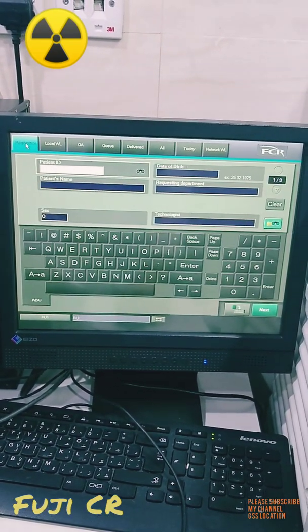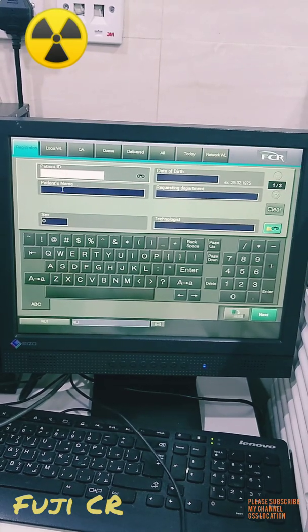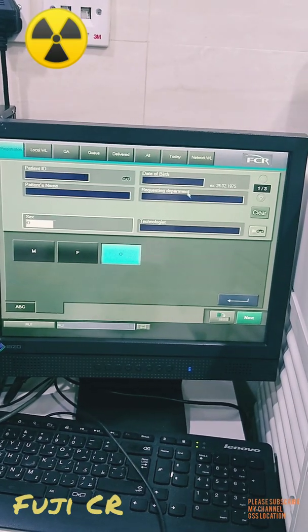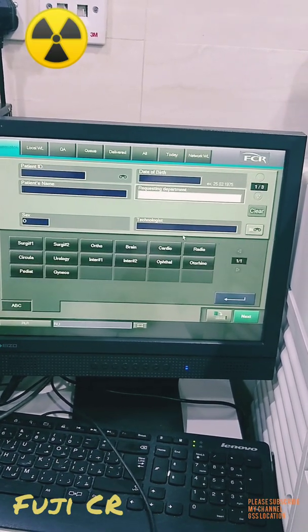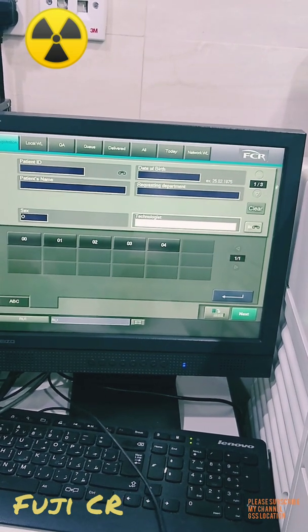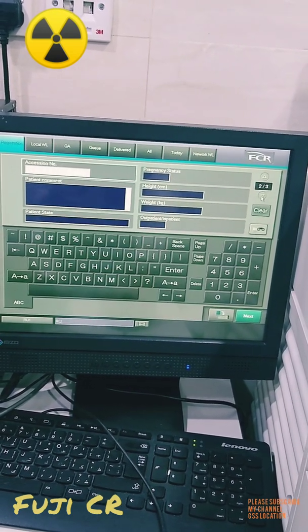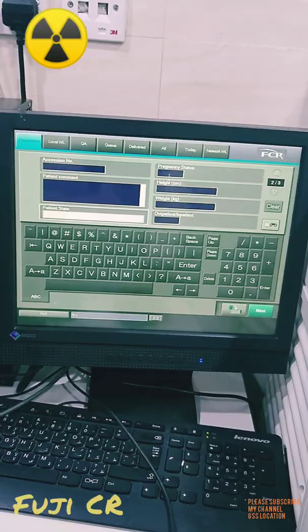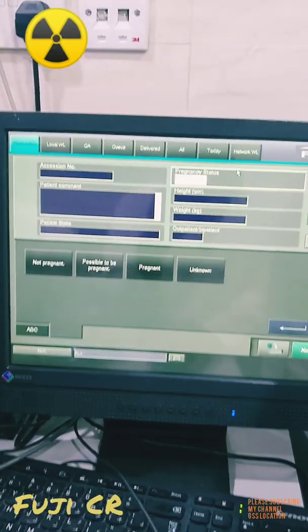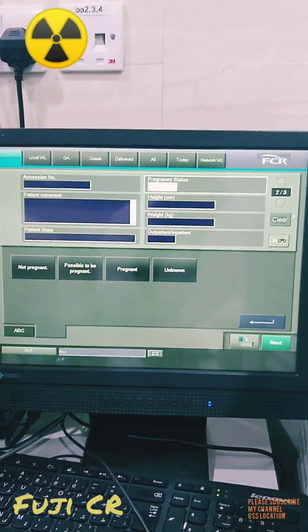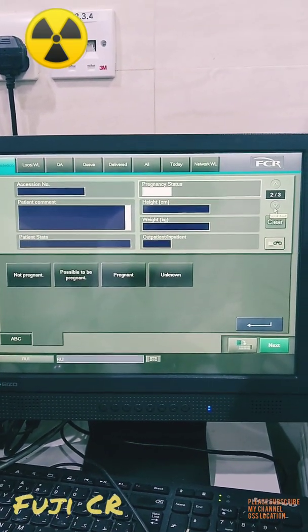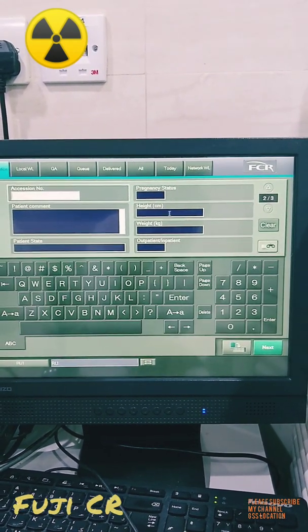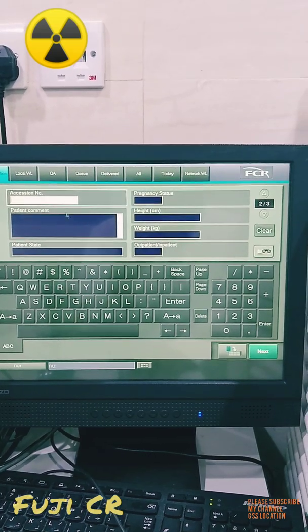This is the platform we are using for the Fuji CR — Computed Radiography. There are multiple options like Registration, Local, QA, Queue, and Network. 'Local' means if anyone is using it manually, you have to enter patient name, ID, and other details according to your hospital protocol.